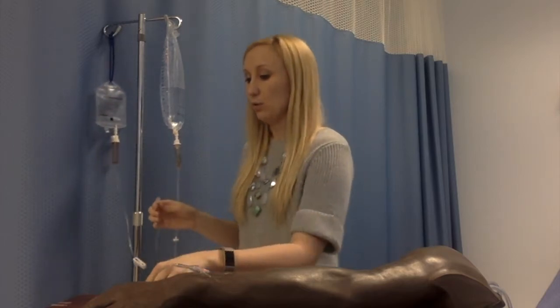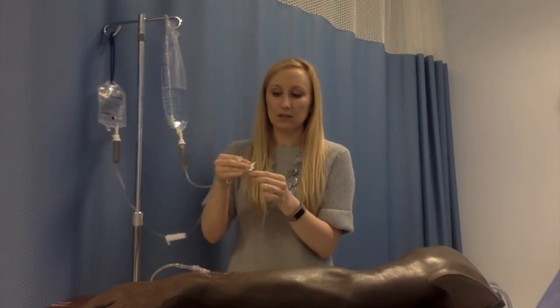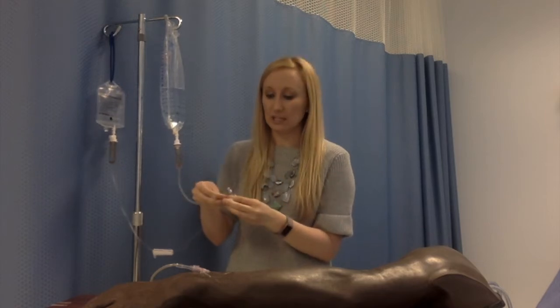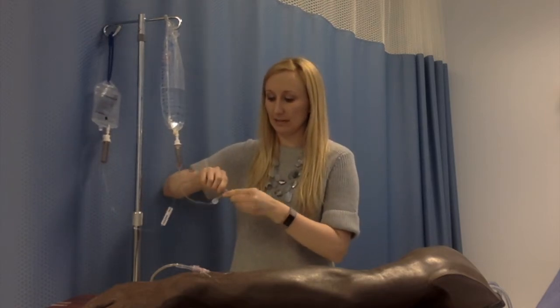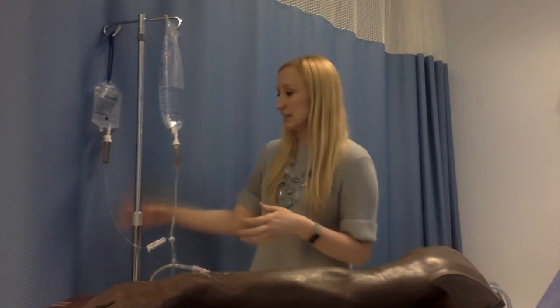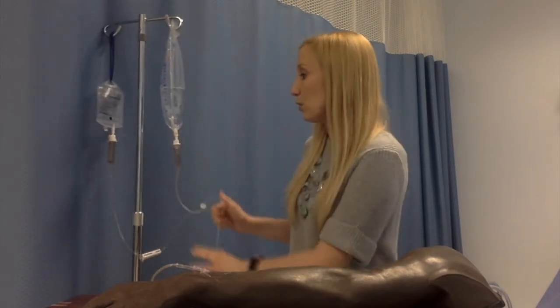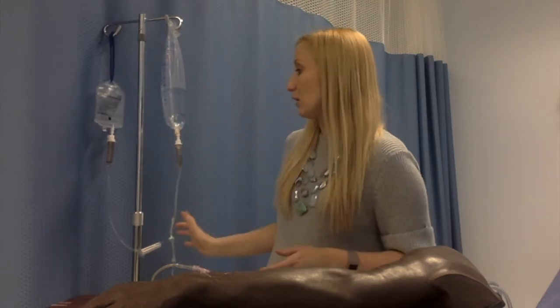And what you do is when you're going to give a medication via piggyback, you will connect it to your main line, your primary tubing. So you're going to clean off the site really well, the port, and you would connect the piggyback and the secondary tubing. In a hospital setting, you're going to have a pump that's connected to this pole, and you would just clamp in the IV line, and you would program your pump for how long you want the solution to be going into the patient, over how fast and over what period of time you want it to be going in. So that is your primary tubing, secondary tubing, and piggyback solution.